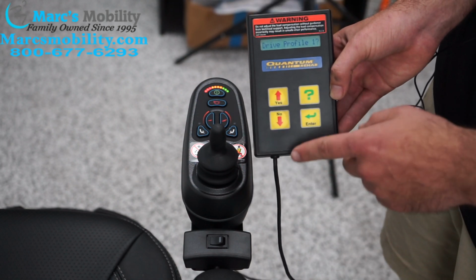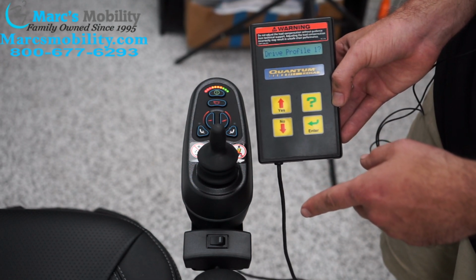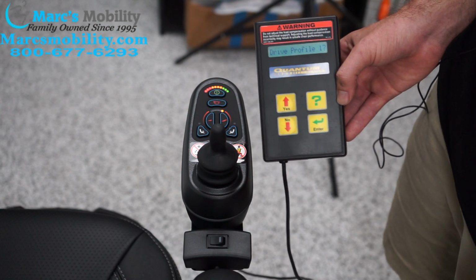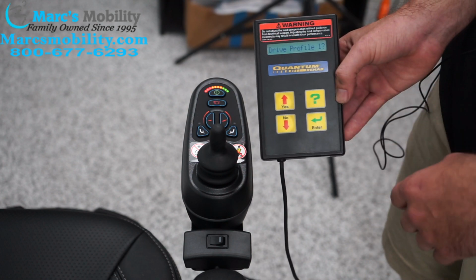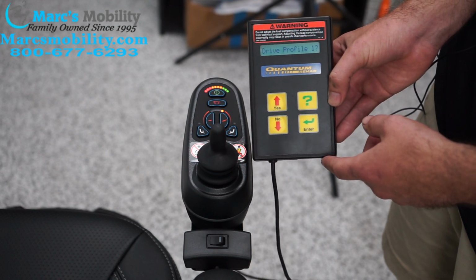So when editing the profiles in the tuner, it will automatically save to the joystick. So you can edit and drive the chair and see what they feel like if you need to. You don't need to turn the power off and back on to save it. It will save automatically. And that is how you program a Jazzy Air 2.